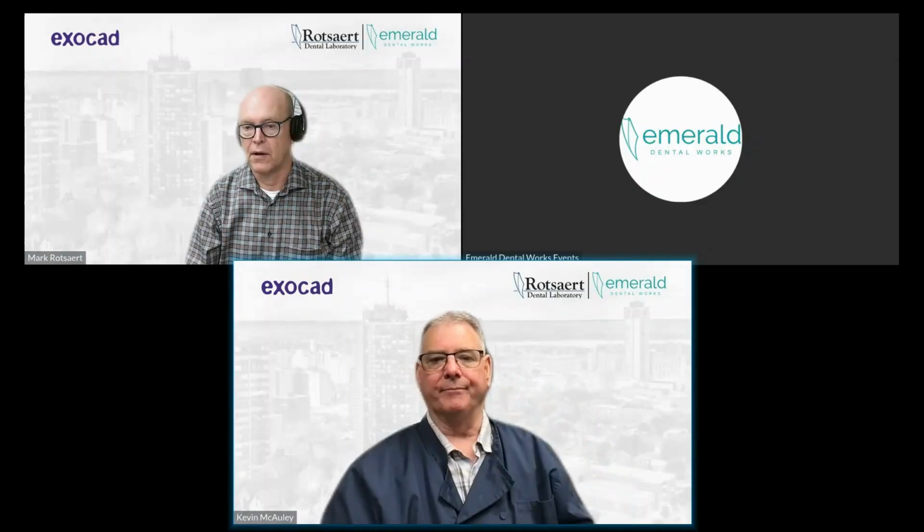Good question. When doing a surgical guide for complete edentulous cases, would you do an acrylic reline of the denture if using the original before the CBCT? I guess for the accuracy of the fit in the mouth. Yeah, good question, and ideally, yes. Do it not as a soft liner but as a harder acrylic reline, because a soft liner doesn't show up; all you see is the trimmed back denture. Ideally, a perfect fit is always better, and the surgical guide will fit that much better.